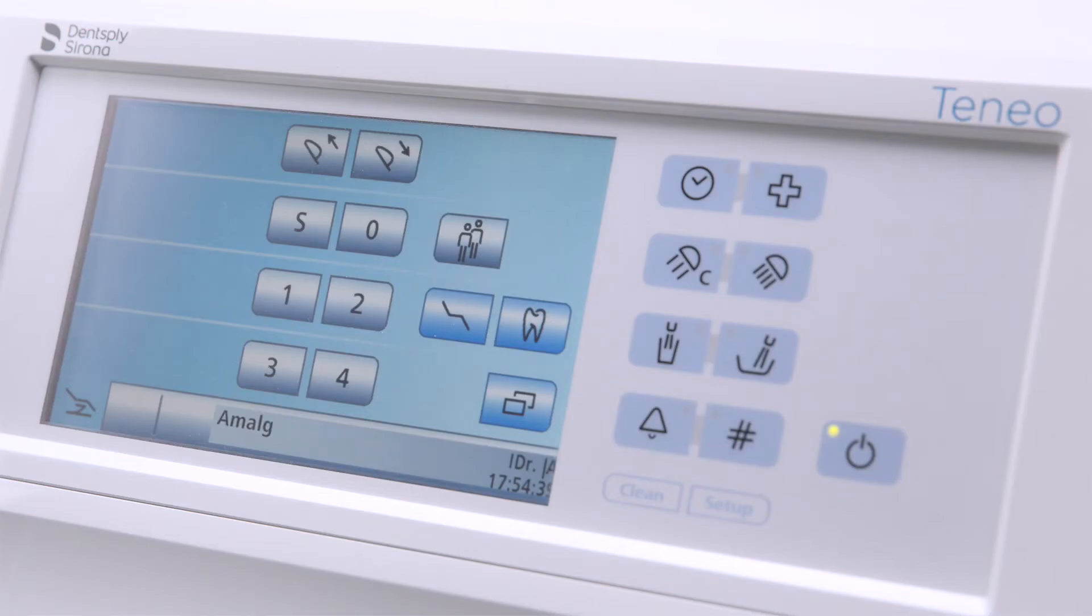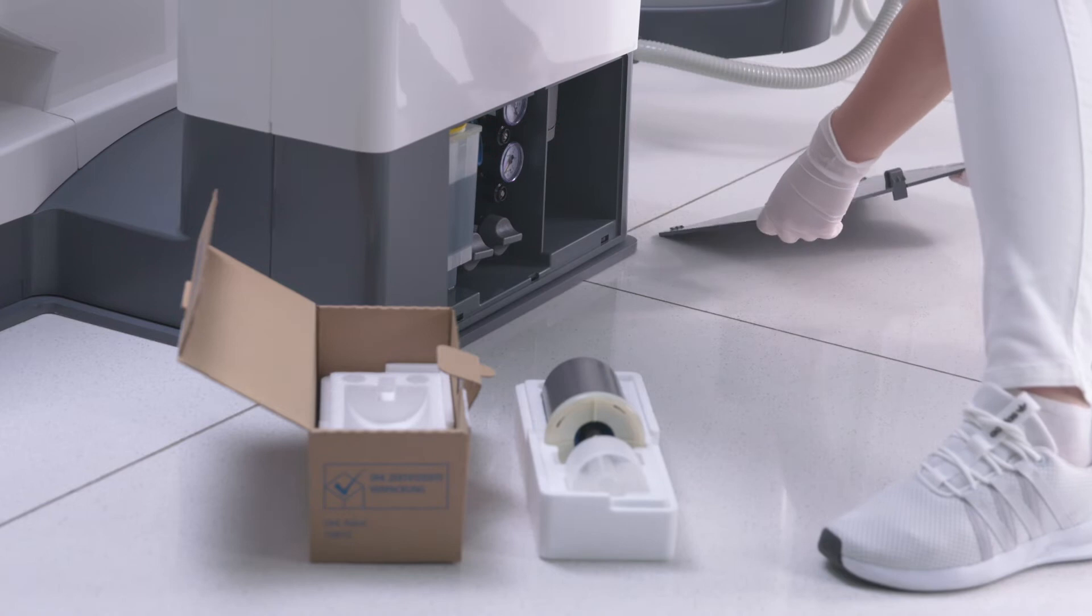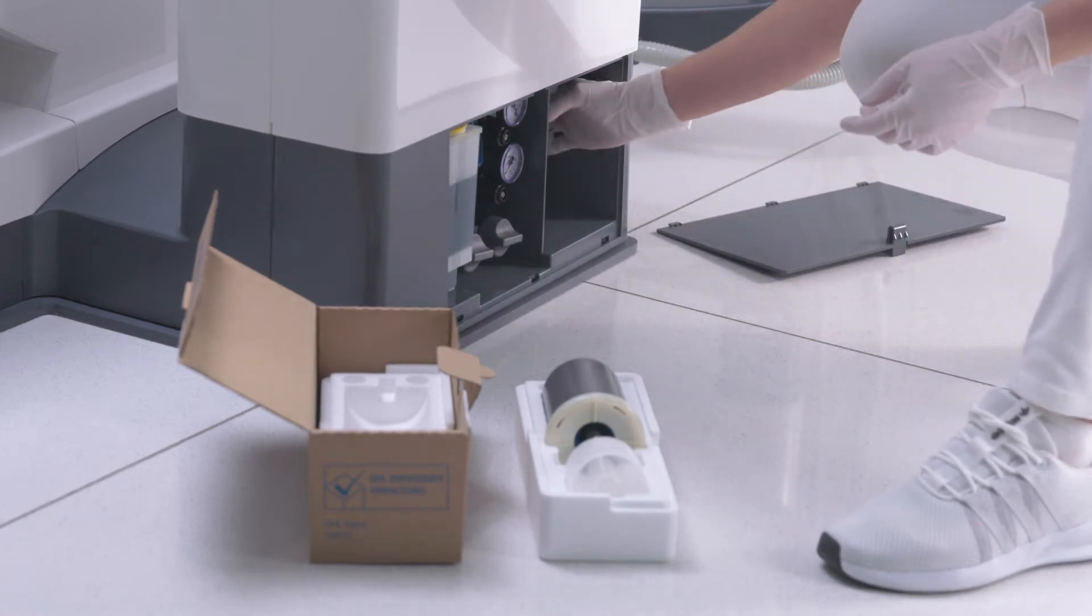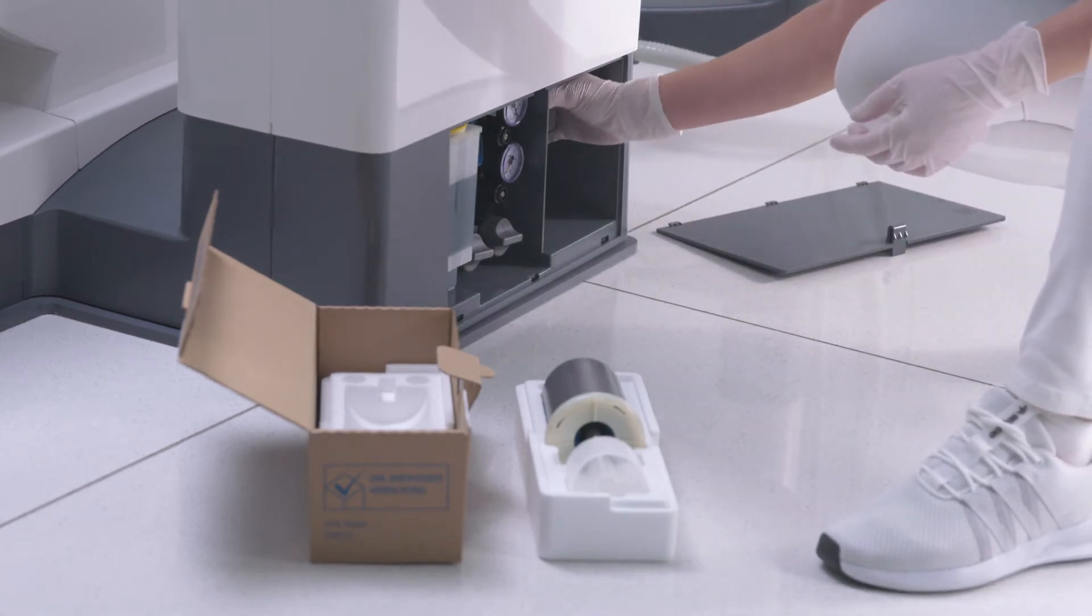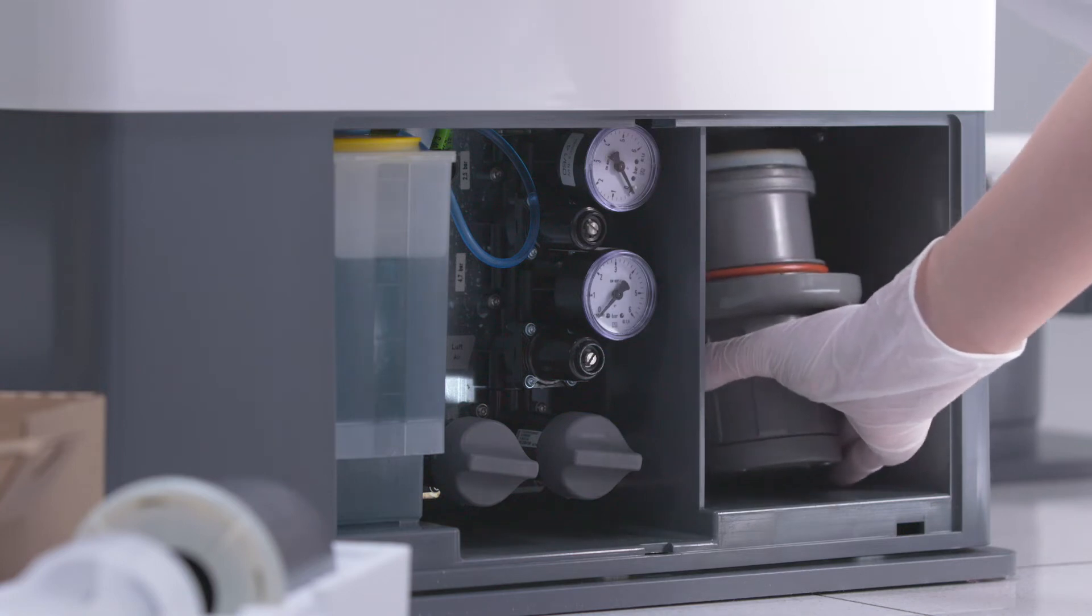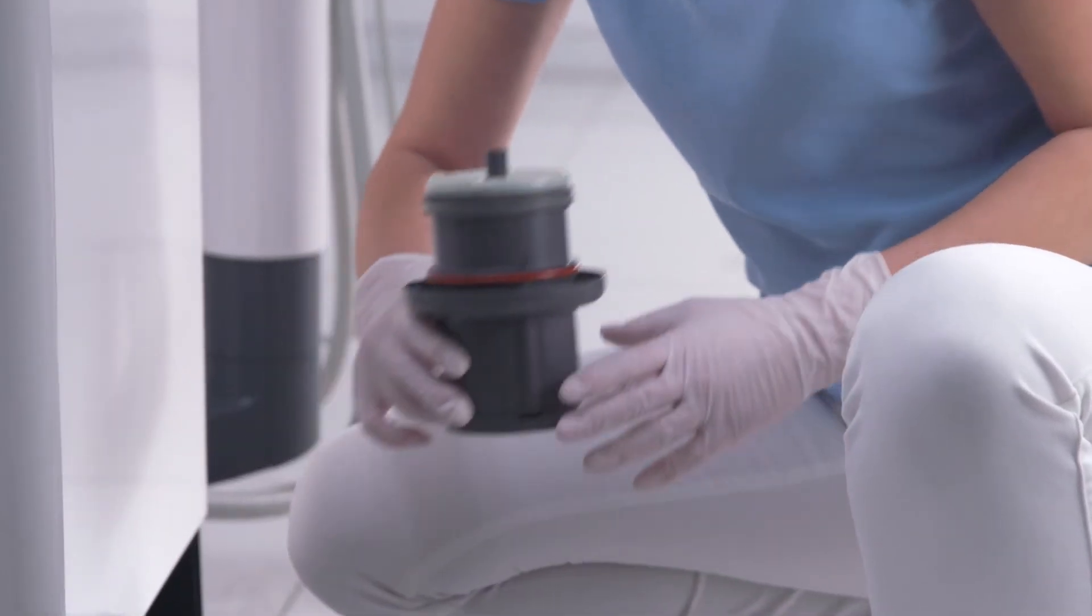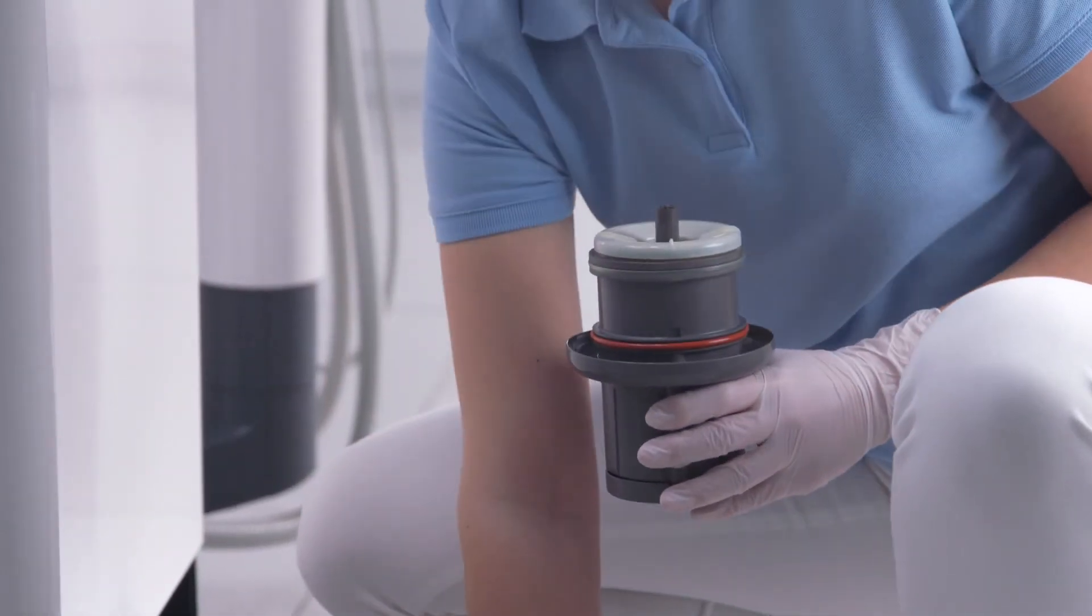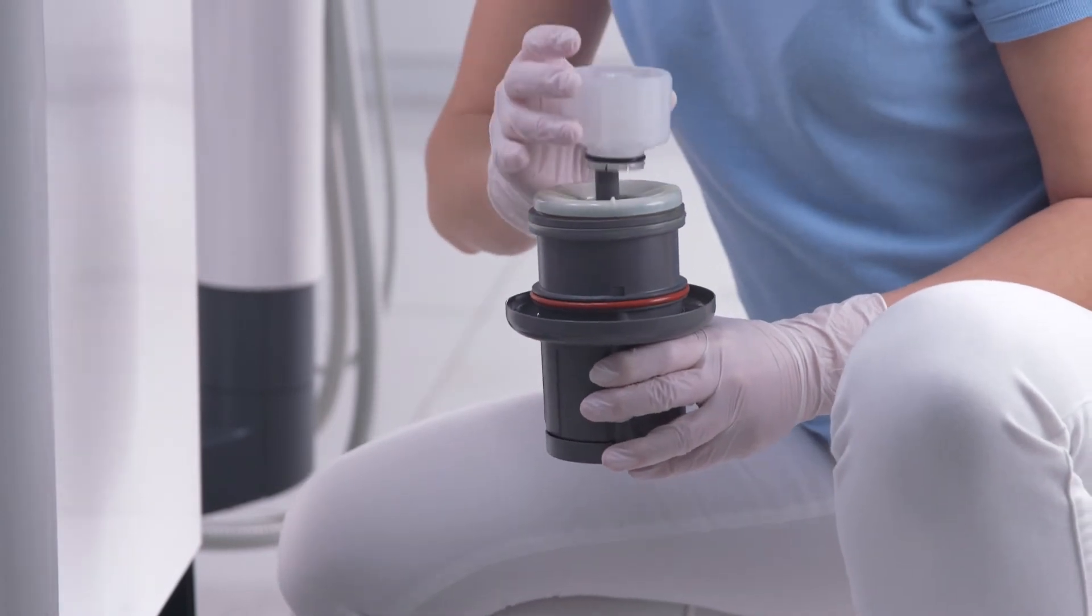If the amalg display appears in the status line of the EasyTouch, change the amalgam rotor. Open the flap on the base of the water unit. Loosen the bayonet catch by turning the lower part of the amalgam separator counter-clockwise. Remove the lower part of the amalgam separator along with the amalgam rotor located inside it. Hold the lower part of the amalgam separator upright.